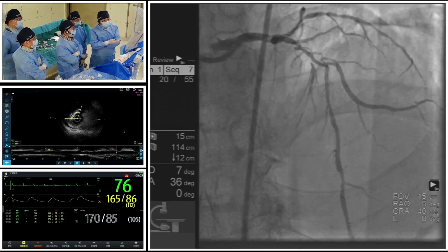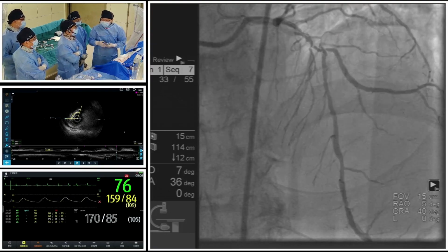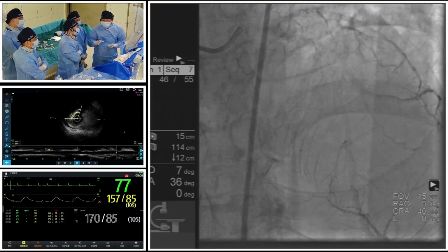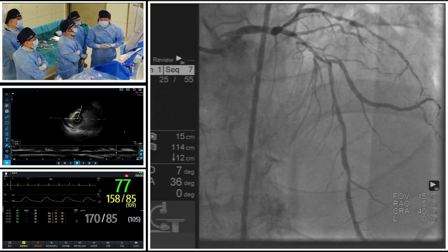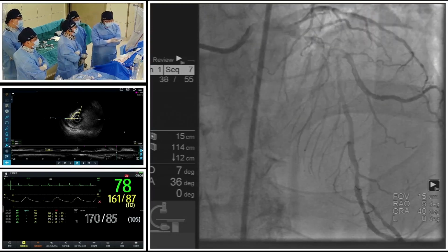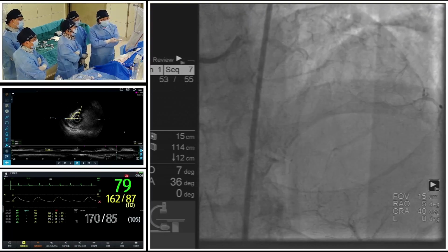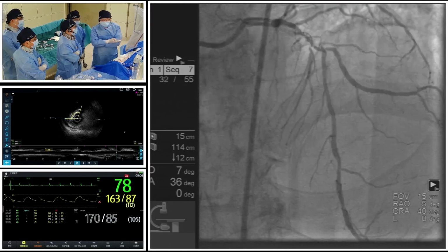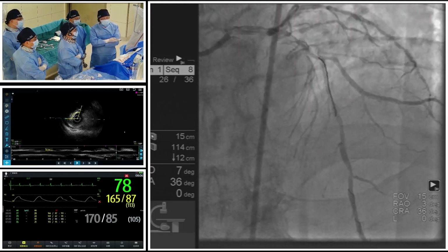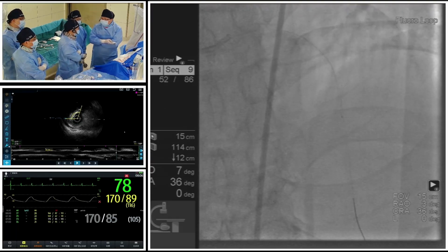Because we already know from the CT 3D reconstruction that there is a calcified lesion at the ostium of the distal left main, and the ostium of the circ is relatively normal, we prefer to choose a one stent strategy. So in order to better debulk the left main calcified lesion, we choose the active Rota technique.